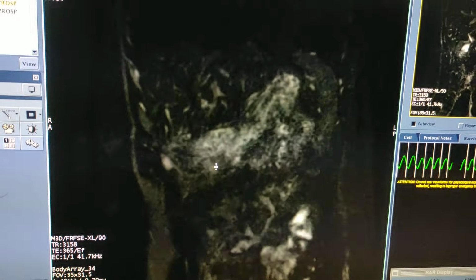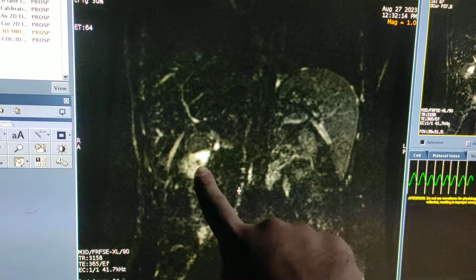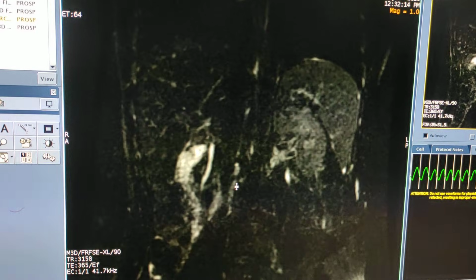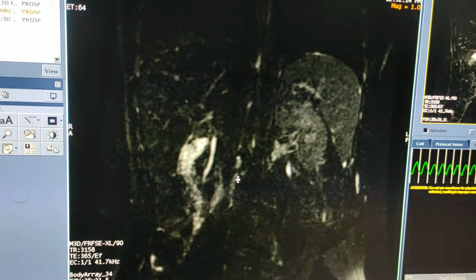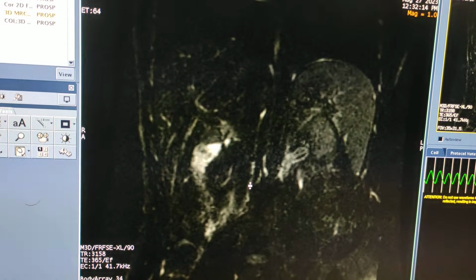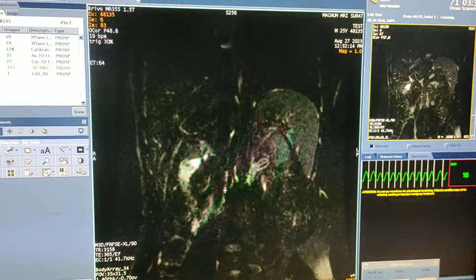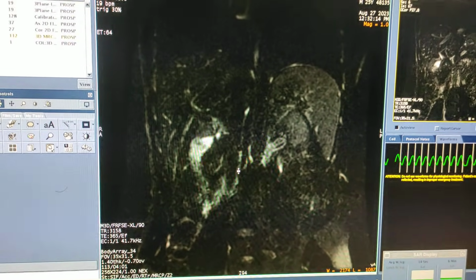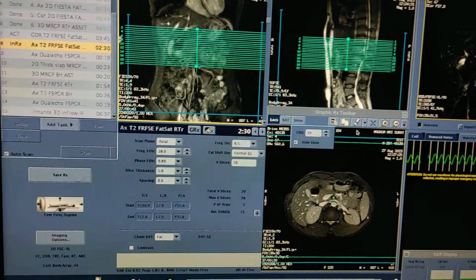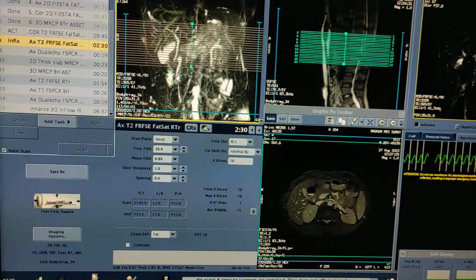So you can check over here. Here is the CBD, here is the gallbladder. CBD is draining over here. And this is the pancreatic duct. This is the pancreatic duct. Okay. Now afterwards you have to post process for a better view. Now I will enter this 3D in the coronal box for better planning.